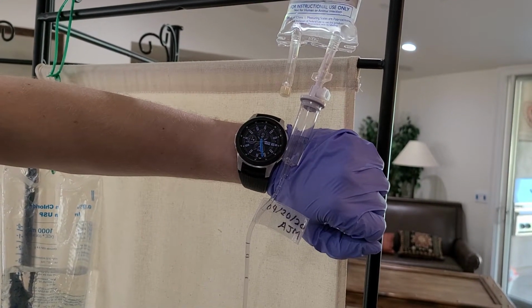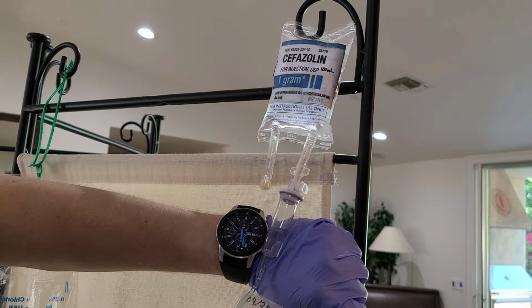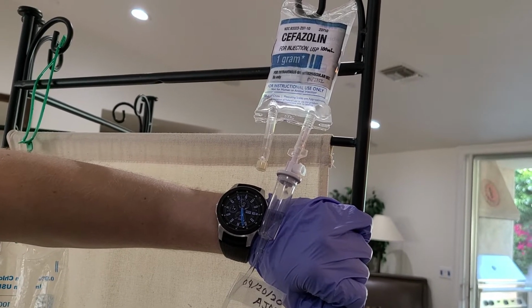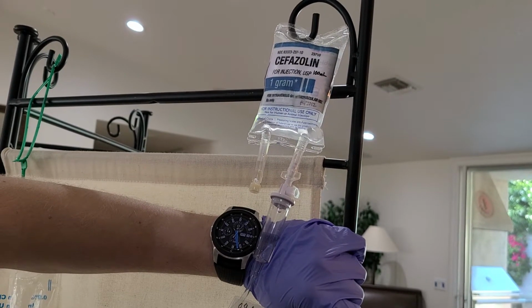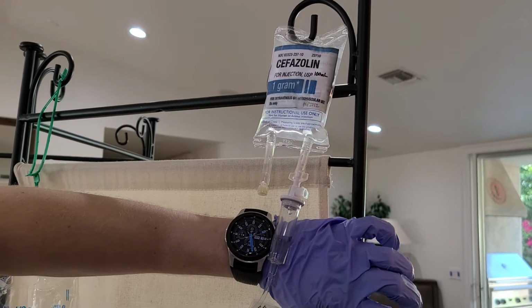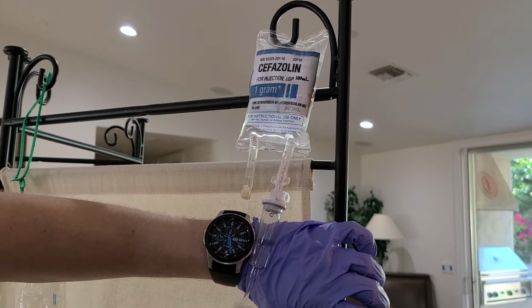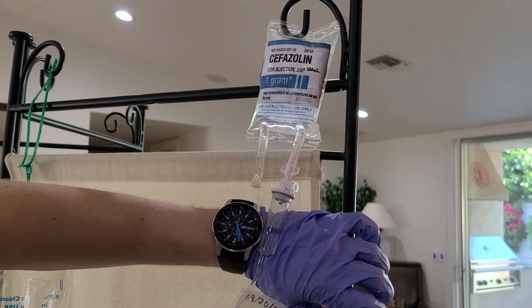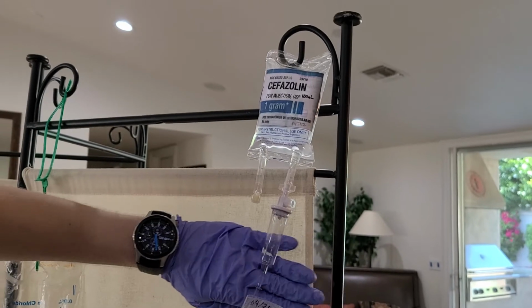I'm going to be very careful not to let out too much. All right, so I set it for 13 drops every 15 seconds.